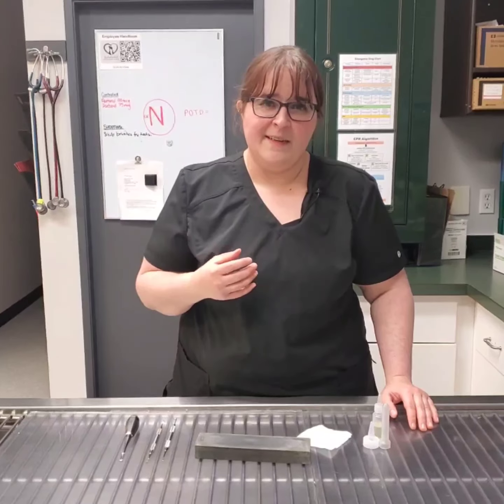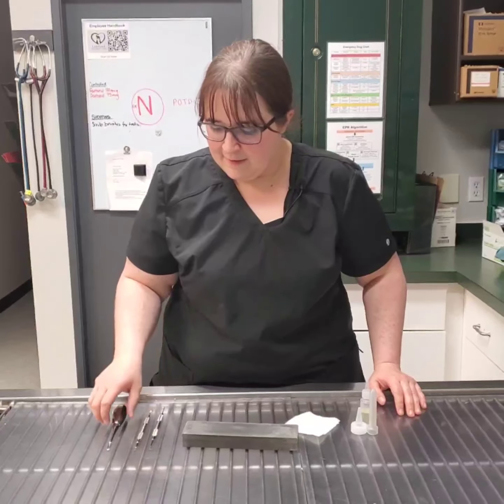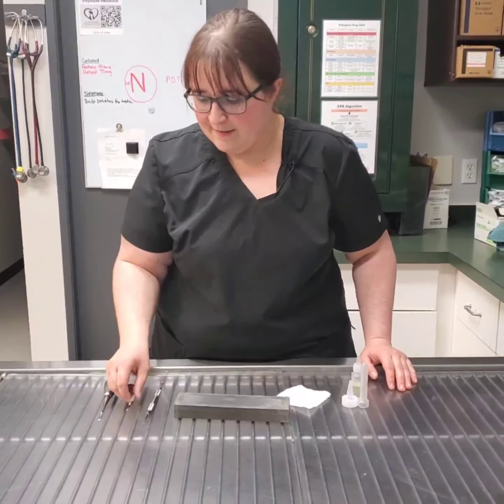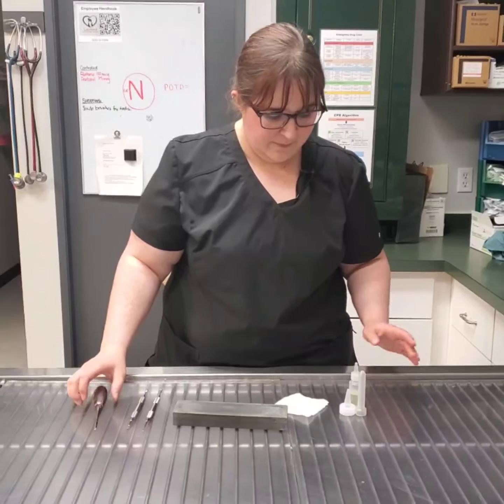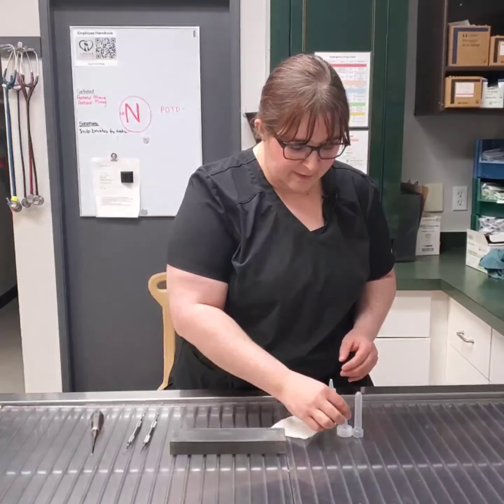I'm Sheena Larson, and today I'm going to be going over how to sharpen some of our dental instruments. So I have a scaler, a universal curette, and an elevator, and I have the sharpening stone, some sharpening oil.